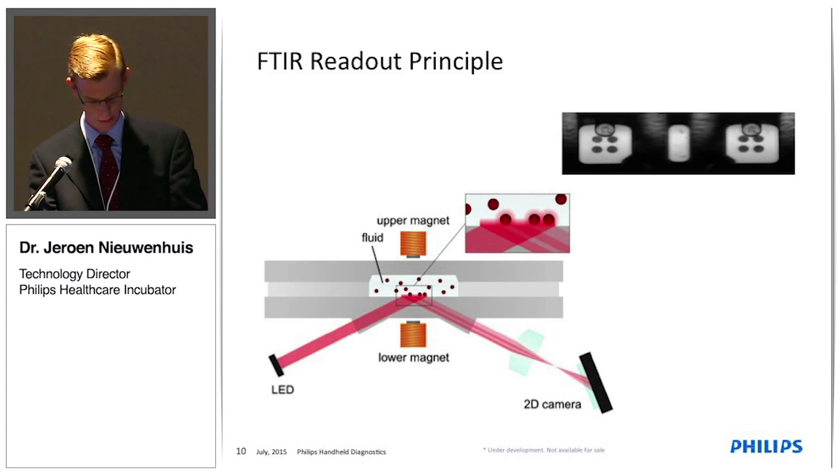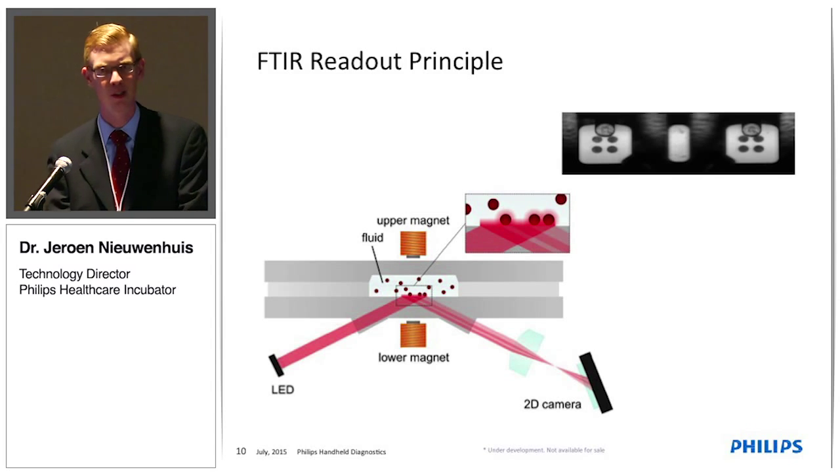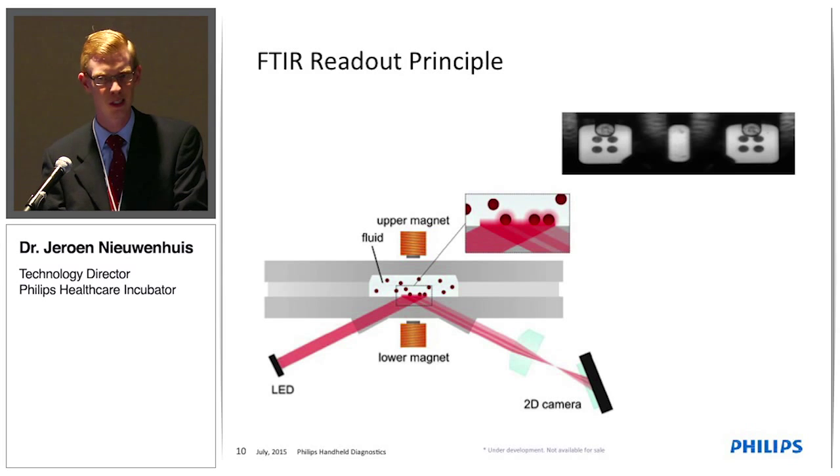You can see here, we have the two reaction chambers over here. This is an optical reference chamber, and you can see in this specific reaction chamber, we printed four spots. You can see exactly those areas where the particles have bound. The surface gets darker. The instrument reads the light intensity at the location of these spots, and that allows us to quantify the concentration of analyte.